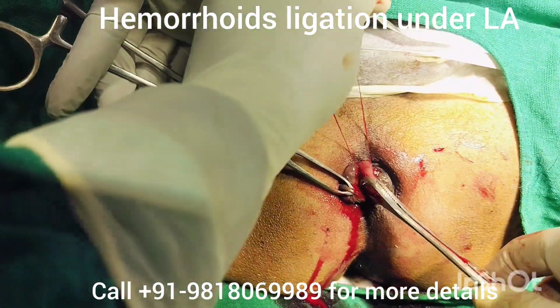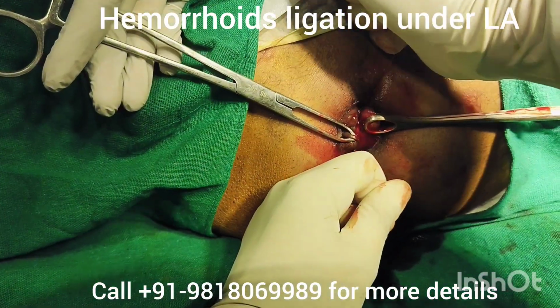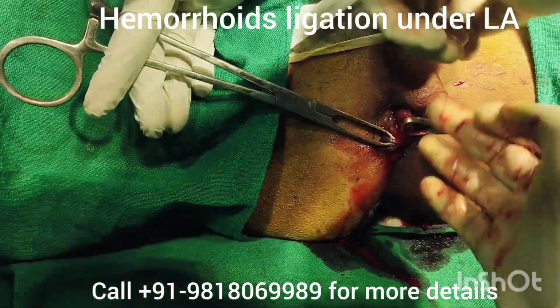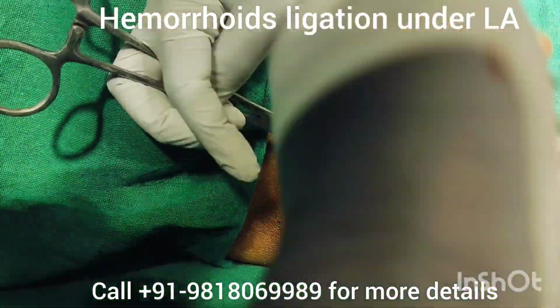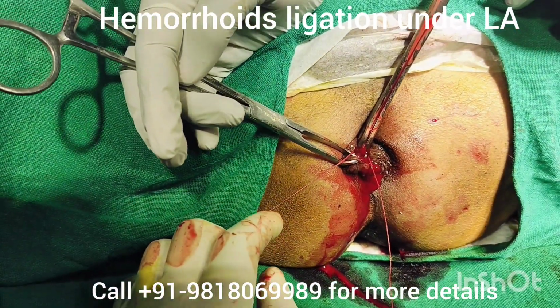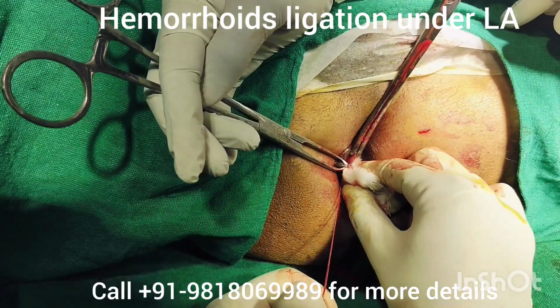Now medial knot has been placed for 11 o'clock position pile mass. Again I will use cautery to separate the mucosa from skin, and thereafter I will place lateral knot after separating mucosa from skin properly.